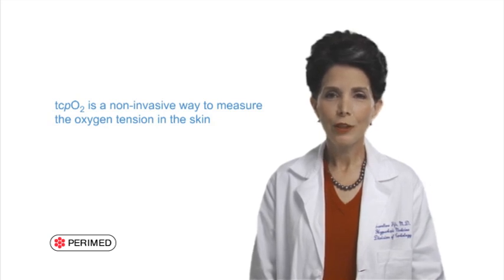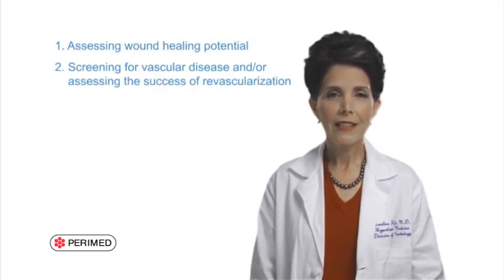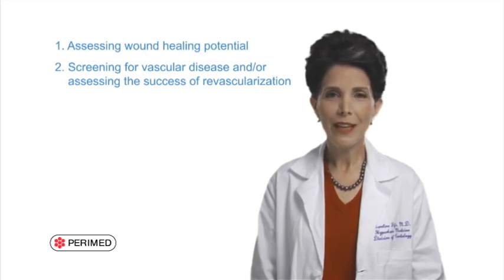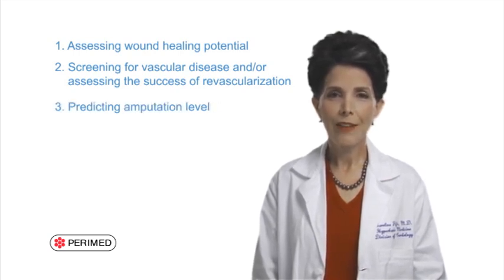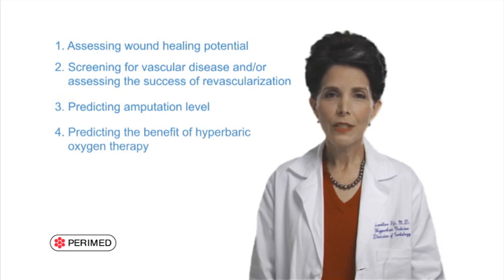I've been using transcutaneous oximetry, often known as TCOM, or more accurately, tcpO2, for the past 20 years. Transcutaneous oximetry is a non-invasive way to measure the oxygen tension, that is, the partial pressure of oxygen in the skin. The 4 applications of tcpO2 we will discuss in this video are assessing the wound healing potential, screening for vascular disease and/or assessing the success of revascularization, predicting amputation level, and predicting the benefit of hyperbaric oxygen therapy. I will refer to evidence-based interpretation guidelines developed by an expert panel and published in the Journal of Undersea and Hyperbaric Medicine.